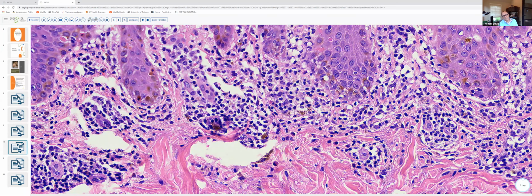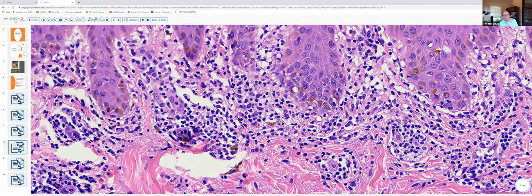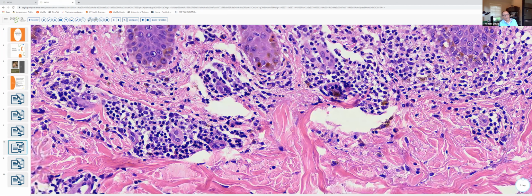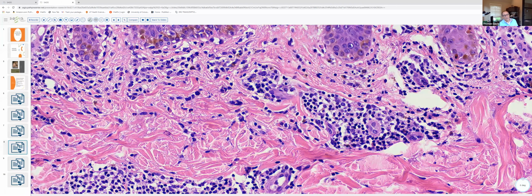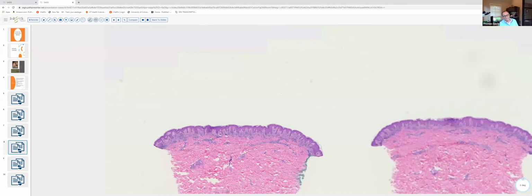What is, however, is the presence of eosinophils within the infiltrate. As you move along the DEJ here, if you looked at the sections, there were not only lymphocytes and melanophages, there were rare neutrophils, and then you can start seeing these bilobed eosinophils here. The sections were a little thick, but I think these were clearly identifiable as eosinophils. And when you start seeing those in number, you need to think about a fixed drug eruption.